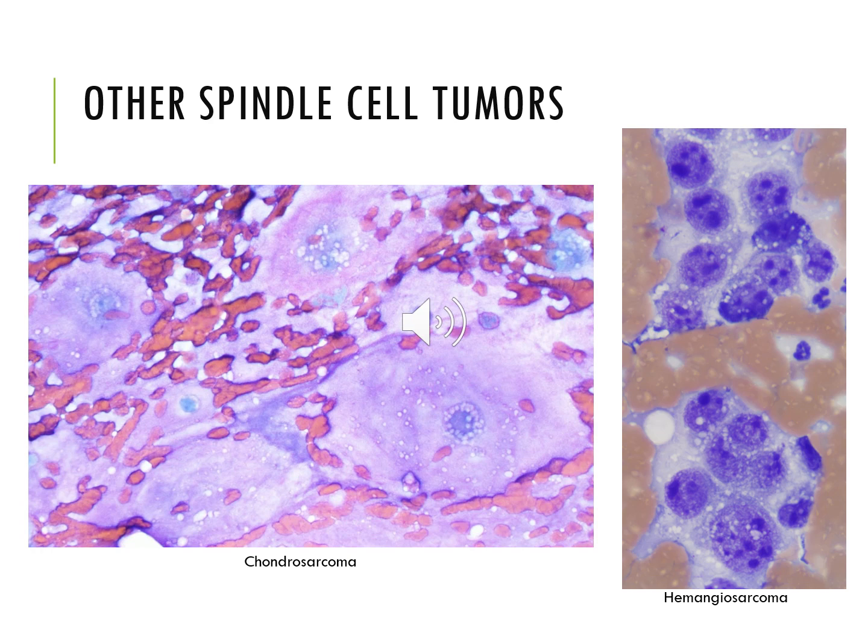I think in the 2 years that I've been here, I have diagnosed sarcoma in 2 cases where it ended up coming back as a hemangiosarcoma, and we get probably at least one spleen sample a day where a clinician's concerned about hemangiosarcoma. So we very, very uncommonly can diagnose these on cytology just because they exfoliate so poorly. But since they are pretty common in anatomic path, I felt like the answer to everything was hemangiosarcoma when I was a vet student.